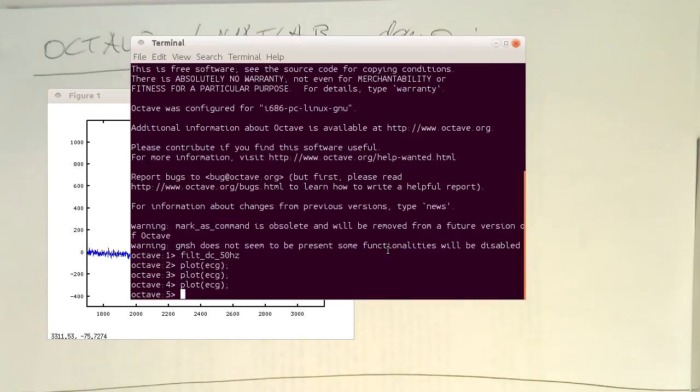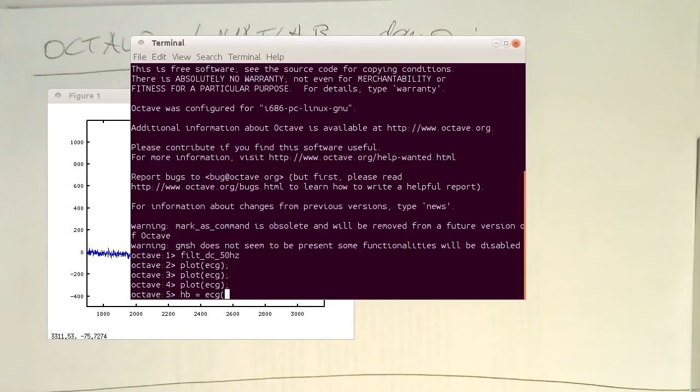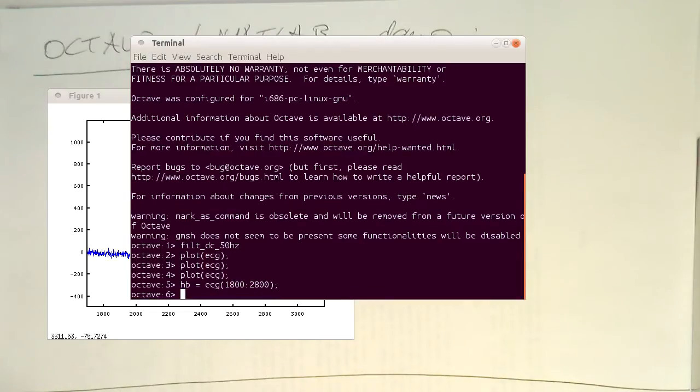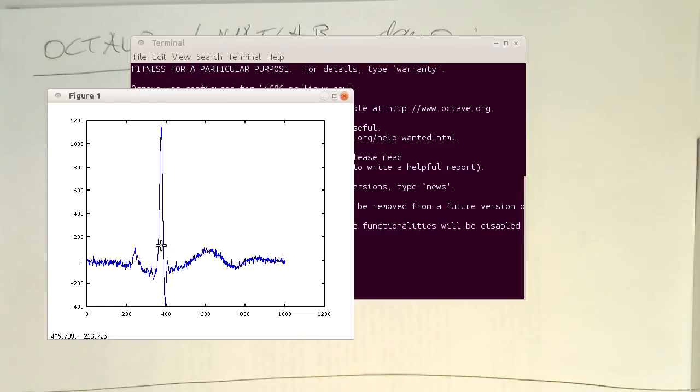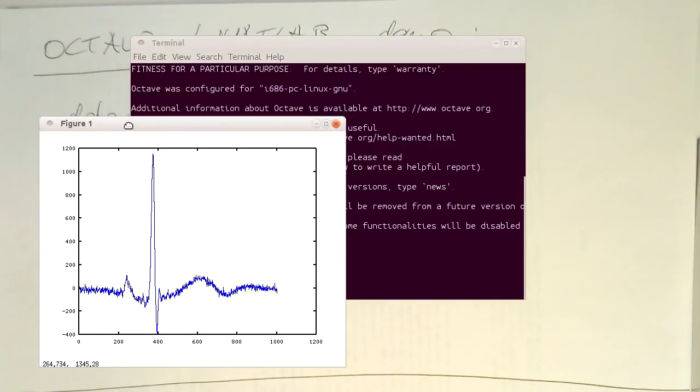So let's do this. Let's call this here the heartbeat. So ECG and this runs from 1,800 to 2,800. Let's see if we are seeing here the heartbeat. Yeah, so that's our heartbeat here.